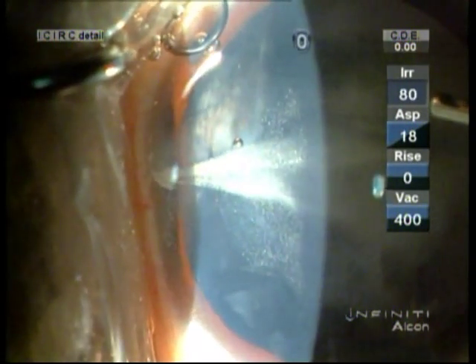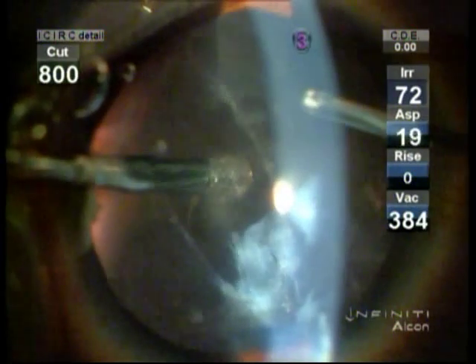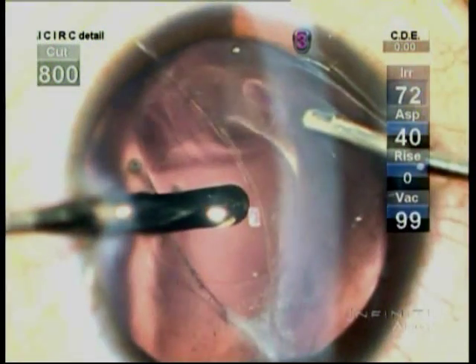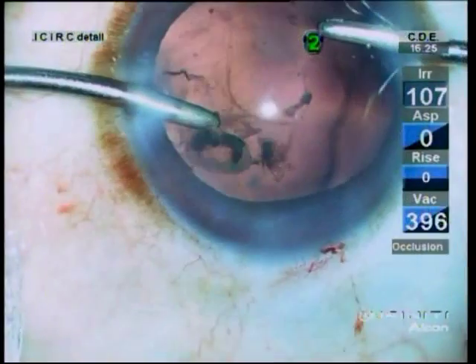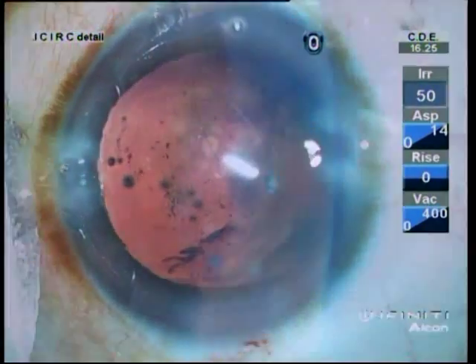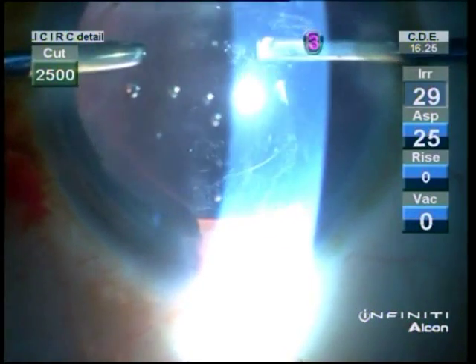For us, this prolapsing vitreous is a deadly enemy that we need to destroy by removing it from where it does not belong, in the anterior segment. So, we usually resort to anterior vitrectomy performed through the limbal approach, because that is how we are most comfortable dealing with our cataract or vitreous, from above, what we call the top-down approach. For example, as you can see here, when the surgeon encounters a posterior capsule rupture, he performs an adequate vitrectomy using triamcinolone as a guide.